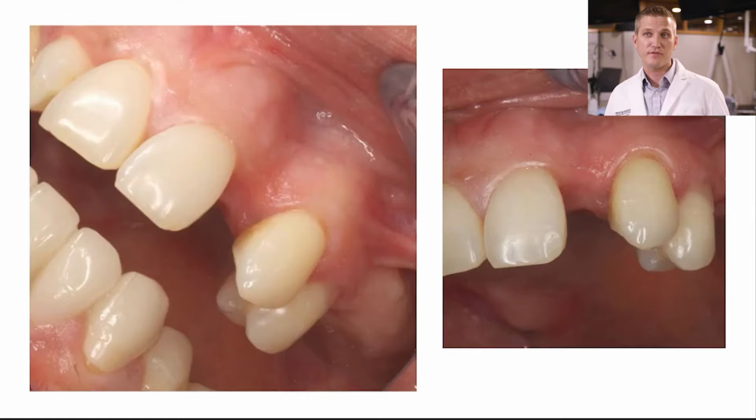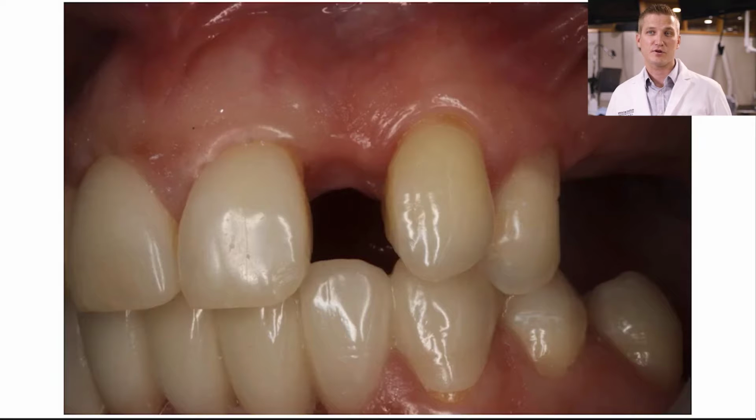Here you're seeing another view that's going to highlight some of the buccal contour issues. So there again, you're seeing the tissues look really good to me, and then a final picture, and then we'll get into some of the virtual planning, the anatomical analysis of the osseous structures that we looked at. So one more site right there. That's our goal for today, is to put an implant in there with a custom abutment and an immediately delivered temporary.